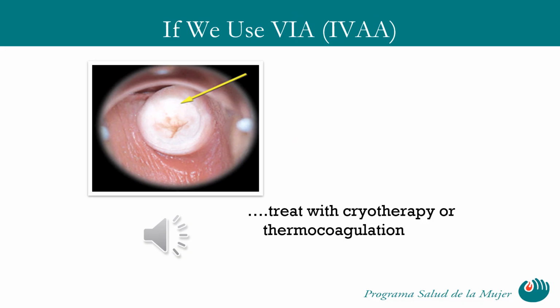This slide shows a photo of the cervix immediately after treatment with cryotherapy. The treated area will be pale because the freezing process causes blood vessels to constrict. After thermocoagulation, the area will look coagulated or charred due to the heat application. After treatment, the patient may experience watery and sometimes heavy discharge as the body expels the destroyed tissue. Patients are instructed to follow up in 1 year or seek medical attention sooner if heavy bleeding, persistent pain, or signs of infection develop.